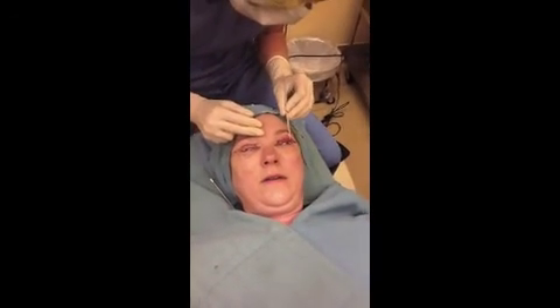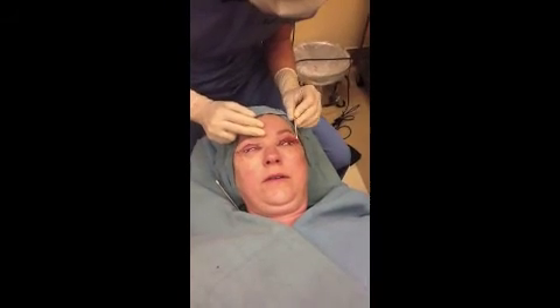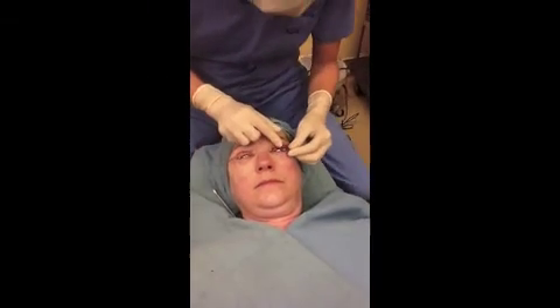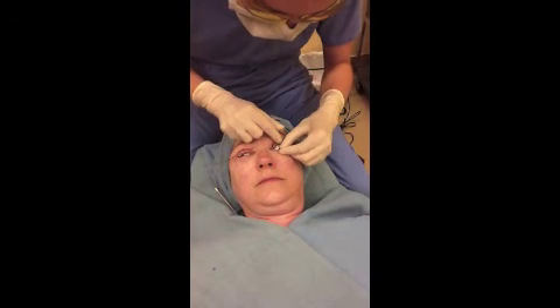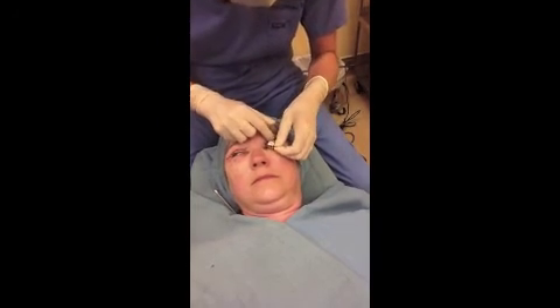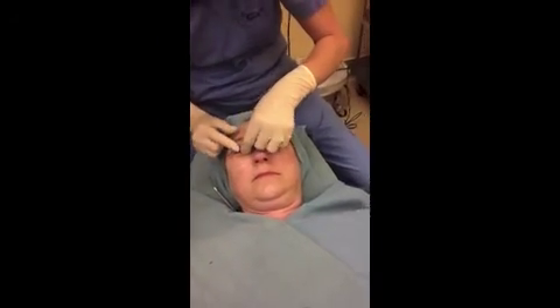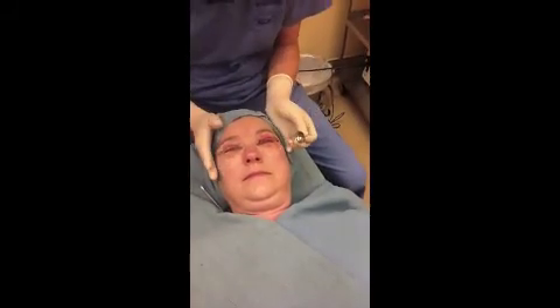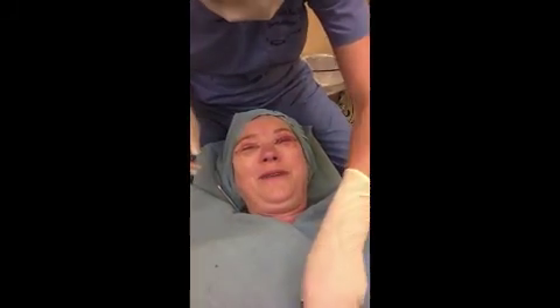If anybody asks me, I'll say the surgery is a piece of cake — the laser is definitely a little more spicy. I'm going to take these eye guides out. I want you to look way down to your toes. And now up. Got enough swelling going on — they're wanting to stick in there. And way down to your toes, and up. Good. Now you can just keep your eyes nice and closed. I don't think I could open them if I wanted to — for four days. It looks good. It went great.